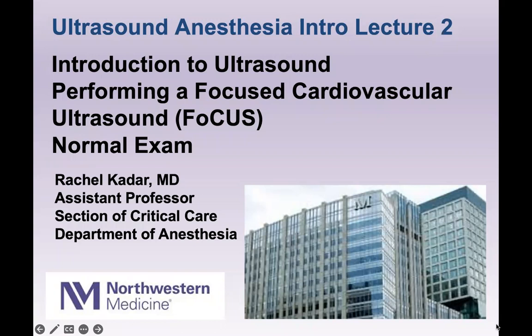Hello, my name is Rachel Kadar, and today we're going to be doing one of our introduction lectures, performing a focused cardiovascular ultrasound or FoCUS exam. Today we'll talk about the normal exam.